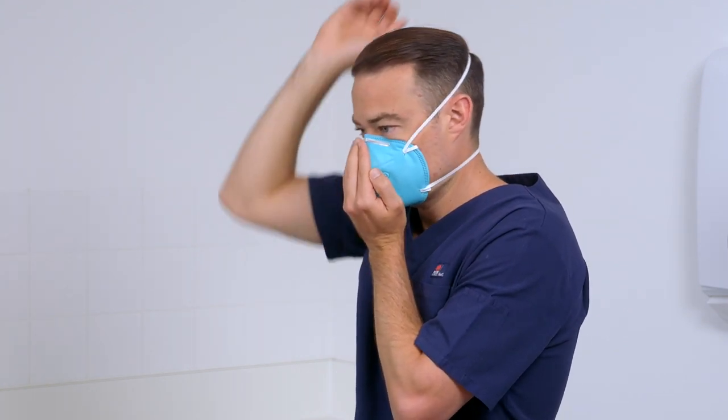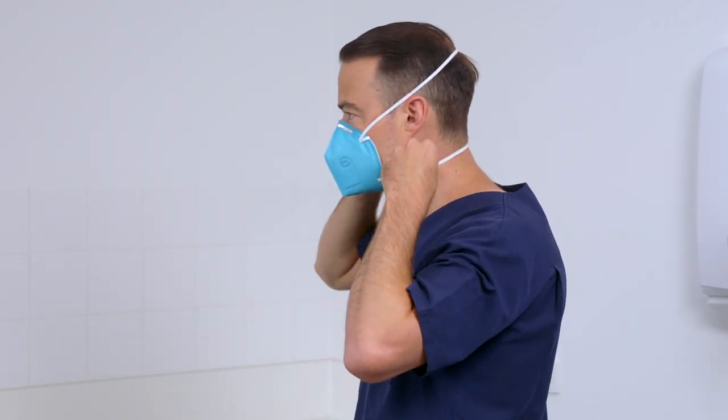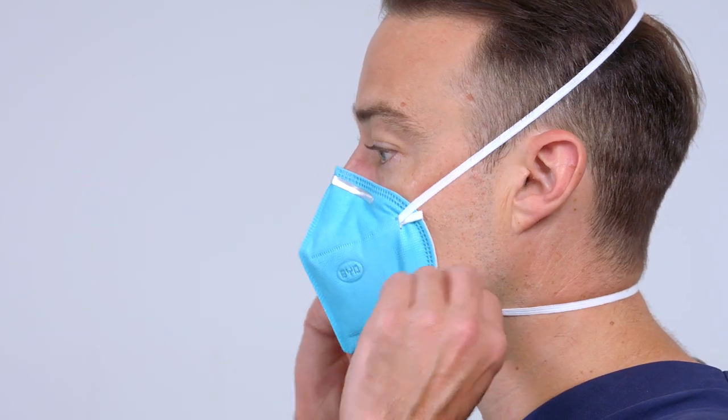The straps must not be twisted. Adjust the straps. Then adjust the respirator at the chin and cheeks.